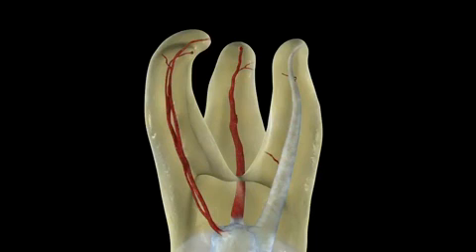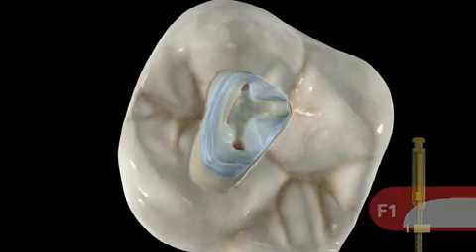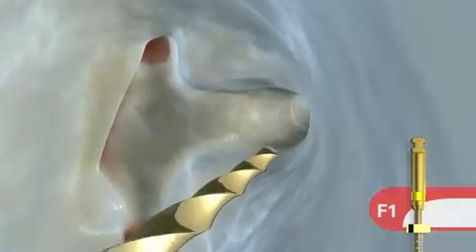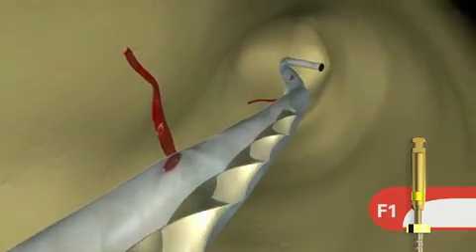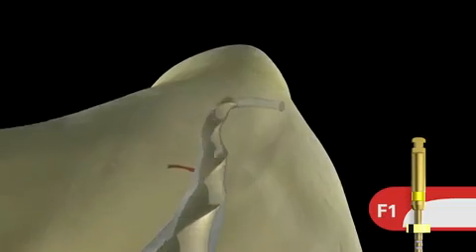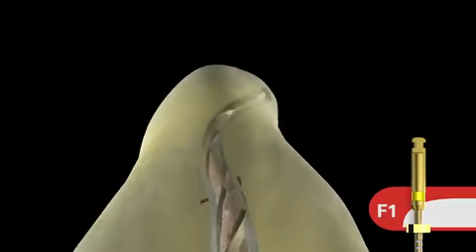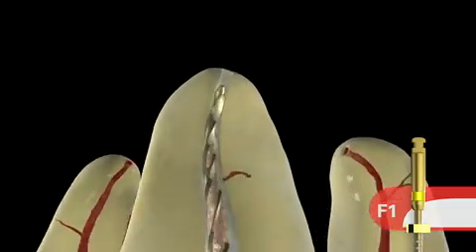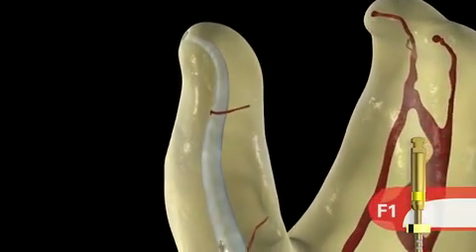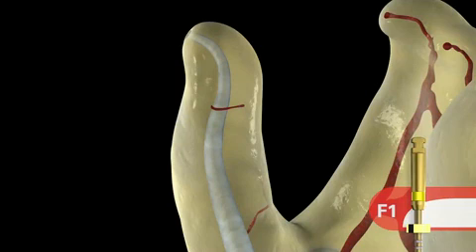That brings us to the regressively tapered finishing files. Again, in a fresh bath of reagent, preferably 6% sodium hypochlorite, the finisher is allowed to run towards length. Notice the finishing file is not continuing to cut dentin in the body. Because of gold wire technology, it perfectly snakes around that apical curvature and arrives at length. Notice the shape is now expanded and is beautifully blending into the body of the preparation.